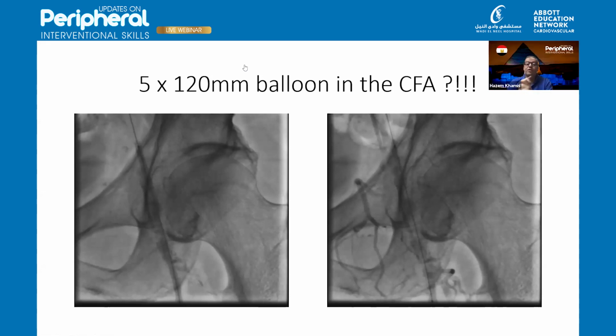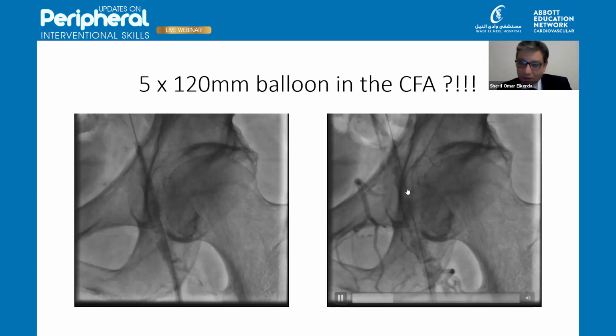Sharif Kirdawi, what will you use? For this heavily calcified lesion, I will use an 018 wire system. But Sharif, I have to ask you: when you were crossing the femoral lesion, what did you think? Was it totally heavily calcified, or was part of this lesion thrombotic, soft, so you could pass easily? No, it was pure calcium. Pure calcium, and you passed transluminal or subintimal? Transluminal with an 018 wire. Okay. Exactly.